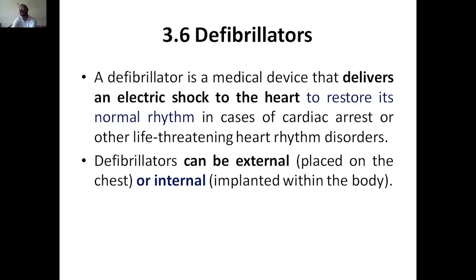Understand it this way: wherever there is a heart attack and we are not able to give medicine, there won't be time for implanting a pacemaker, which we just spoke about. That would also take time, surgery and all, and by then the person won't be there. So in a short period of time we need to restore the electrical activity of the heart.